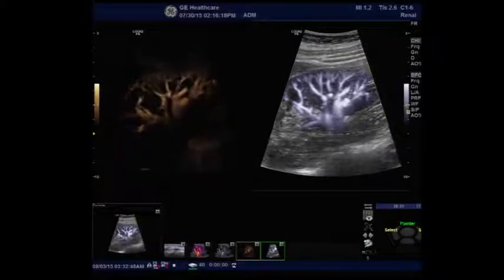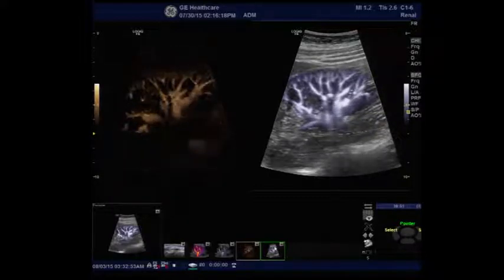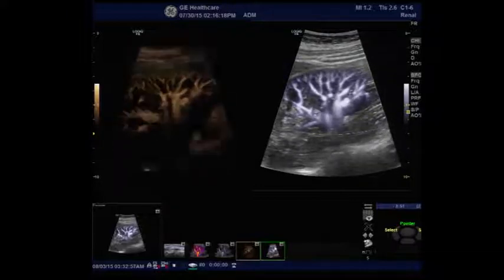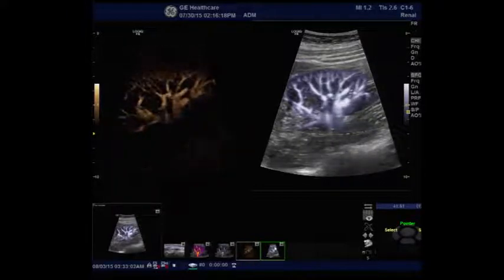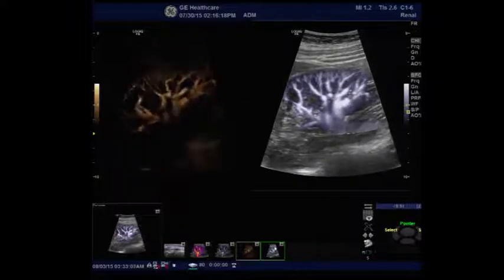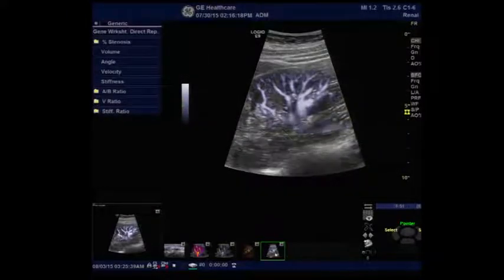Compared to B-Flow, which is not angle dependent and detects the weak echo signals of the red blood cells, B-Flow Color requires an ROI and is angle dependent, similar to Doppler technologies. Similar parameters will be used when compared to power Doppler imaging when optimizing a B-Flow Color image. The overall color gain within the image can be changed by using the color gain knob. This is the first parameter that improves optimization of the B-Flow color.